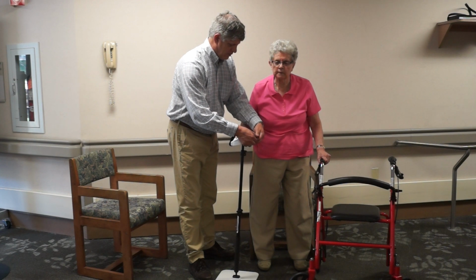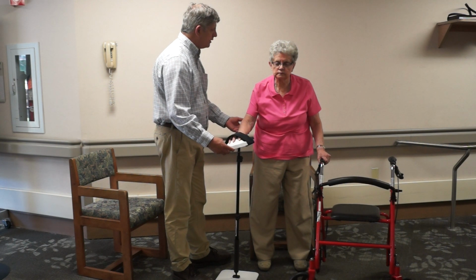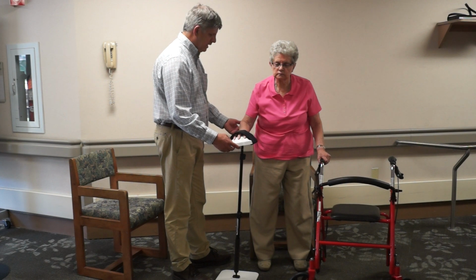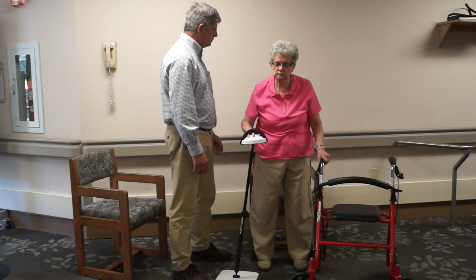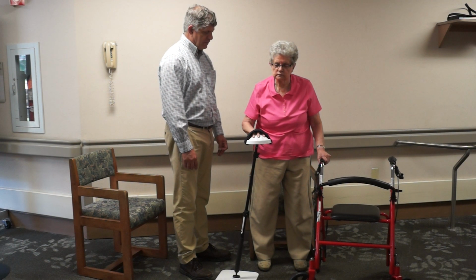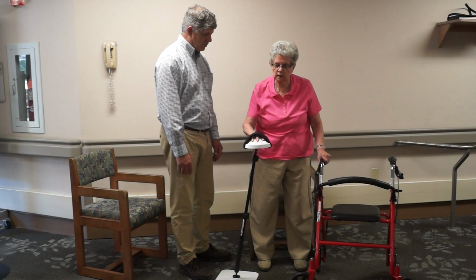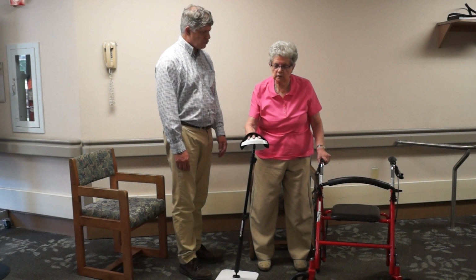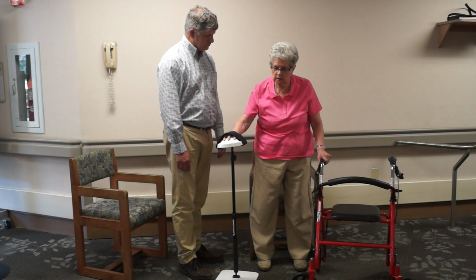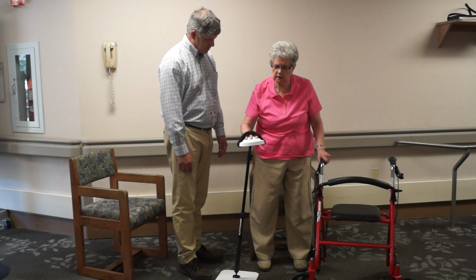Okay. So now, just act like you're reaching for your clothes in the dresser, okay? So just reach forward, make it meaningful, like you're just in your room and reaching for maybe items on your shelf or your dresser drawers, okay? Okay. How does that feel for your balance? I'm just fine, absolutely fine.